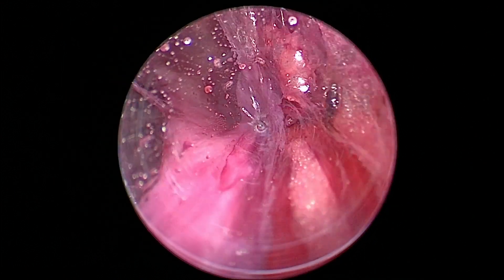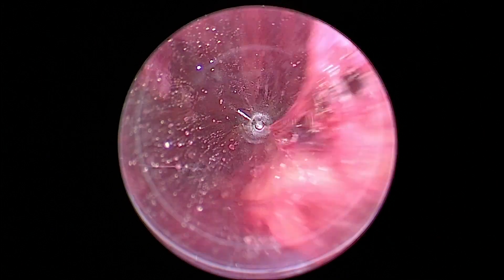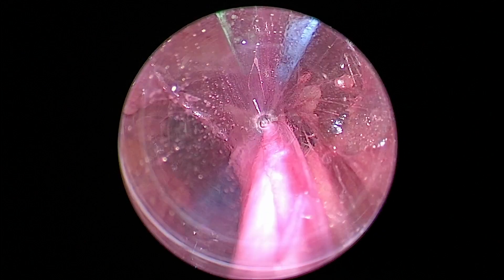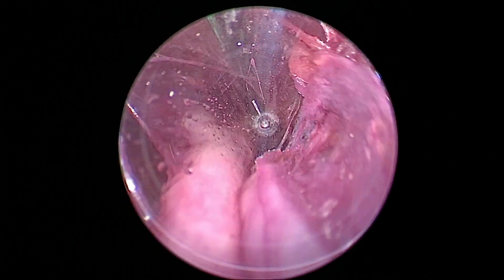Sometimes there's a little bit of adventitia that I didn't get to when I did my dissection, because you want to just do a little bit of dissection before you do this — just the tip. Don't clean off that whole branch.